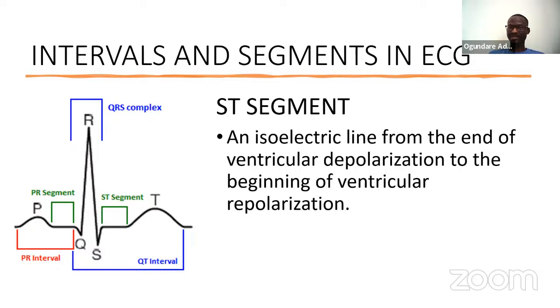Just by looking at an ECG paper report in your hand, looking at the ST alone, you can start making sense of what it represents. The ST segment, just like the PR segment, can be depressed or elevated. Depression is a downward shift like that, and then it can be elevated.